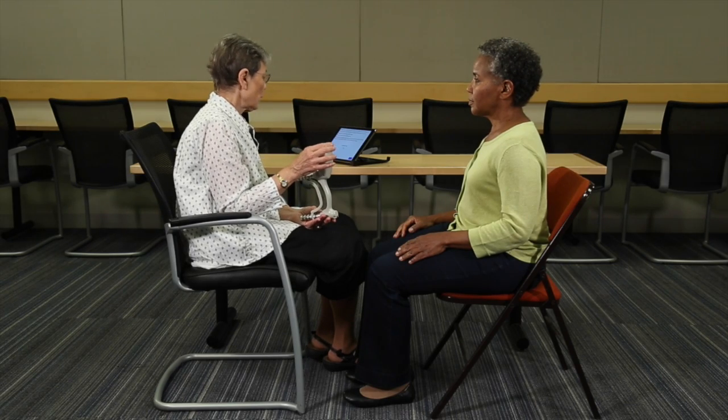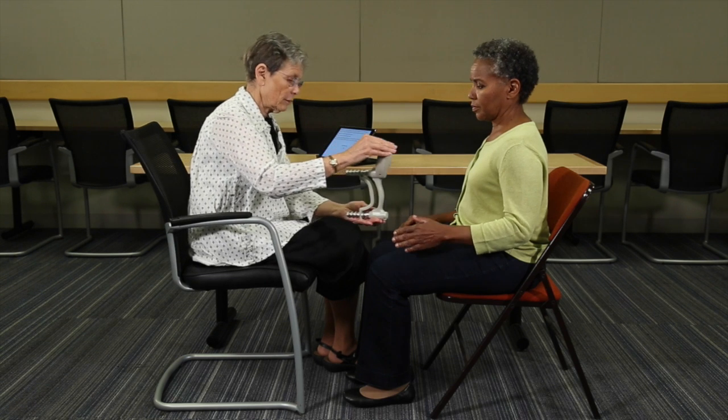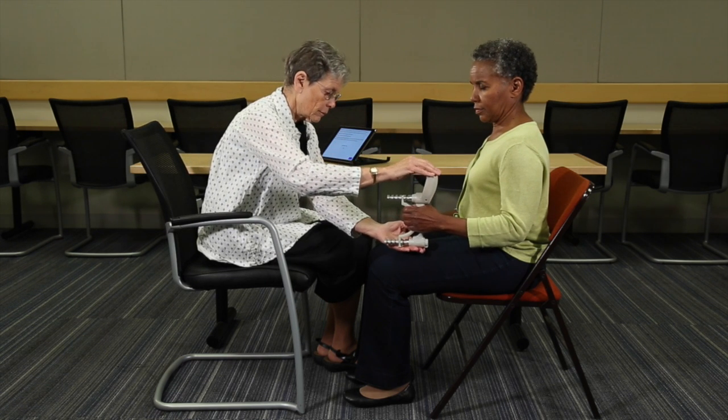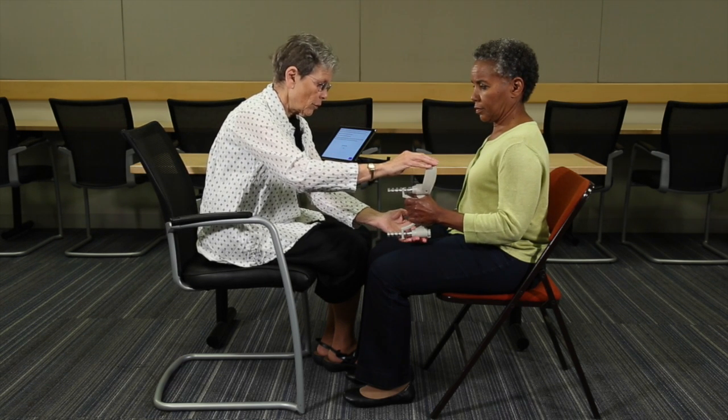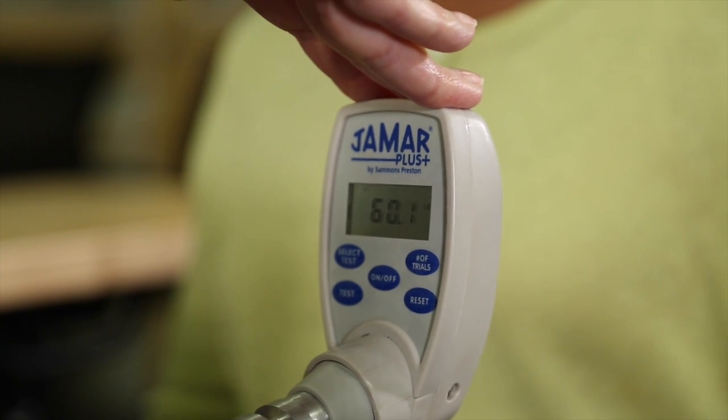Good. Now we're going to test each hand, beginning with your left hand. When I say squeeze this time, I want you to squeeze the handle as hard as you possibly can. Okay? 3, 2, 1, squeeze. Harder, harder, harder, stop. Good job.